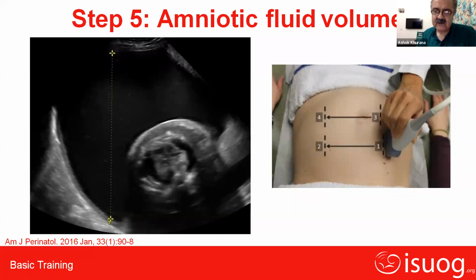And the third very common cause is an intrauterine infection. So if you find oligoamnios, then you must look again for findings in the placenta and the fetus for intrauterine infections, such as fetal fluid collections, fetal visceral calcification, fetal cardiac anomalies, ventriculomegaly, cataract, and placental size. That is very important to make sure that you're not missing a very serious cause of oligoamnios with a poor prognosis, because intrauterine infections have a largely poor prognosis.